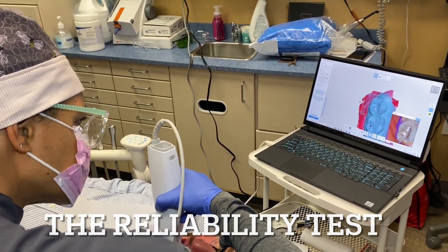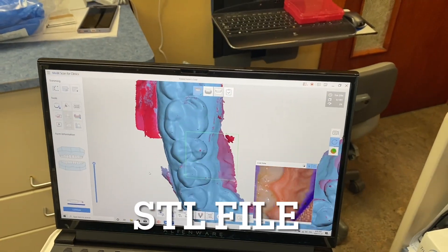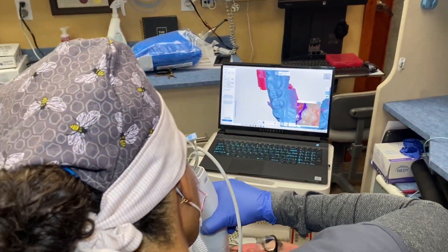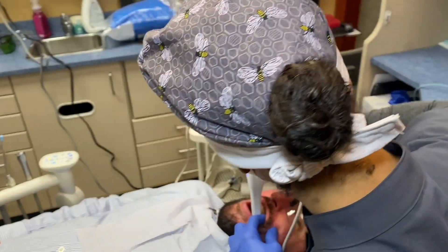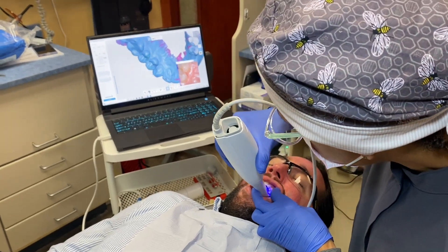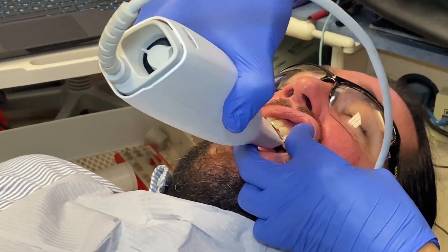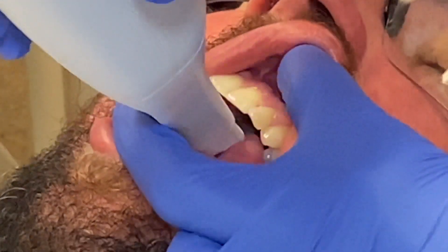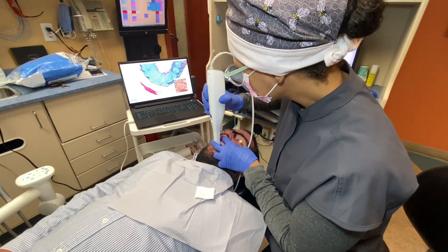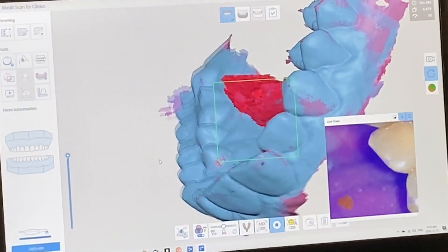The lips are also being taken out by the computer, making it work really quite well. The reliability test is an AI feature that allows us to see where the scan is a bit thin. We're building an STL file here and the blue areas are very adequately done. So as Jessica goes around, this gives her feedback. The audio cue — the guitar noise fading in and out — tells her whether the camera is in focus or not.